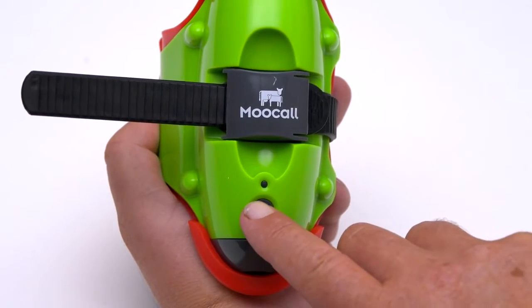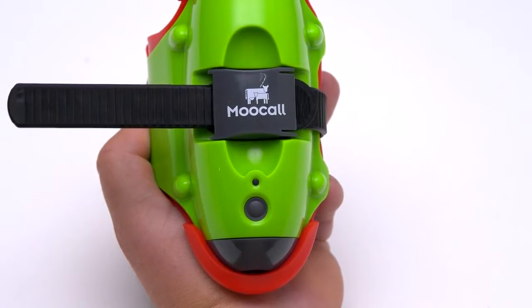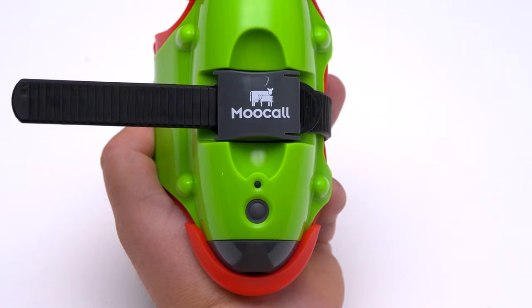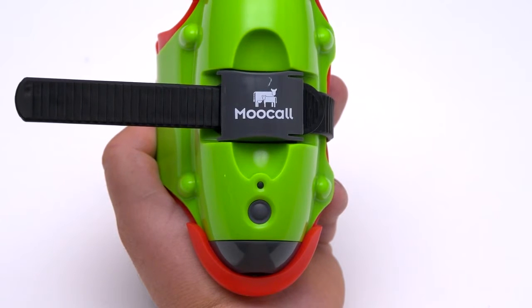To reset the sensor after a calving, press the power button for one second. The light will change from red to blue, and it can now be put on the next cow in line to calve. If the button is not pressed, the sensor will automatically reset itself after three hours.